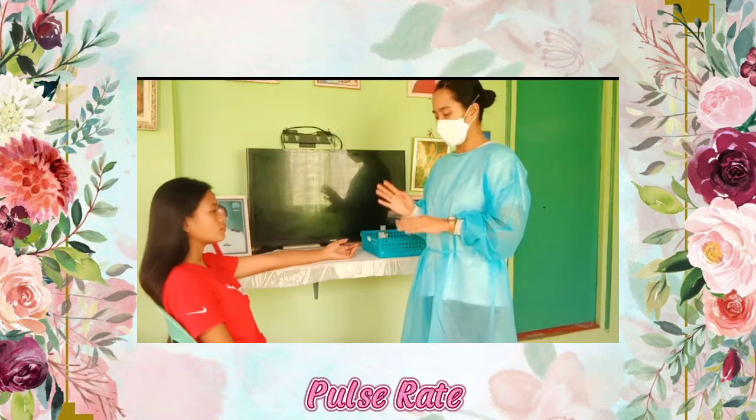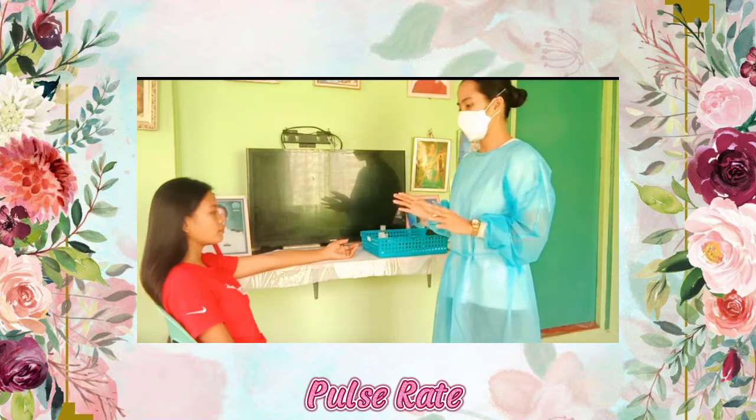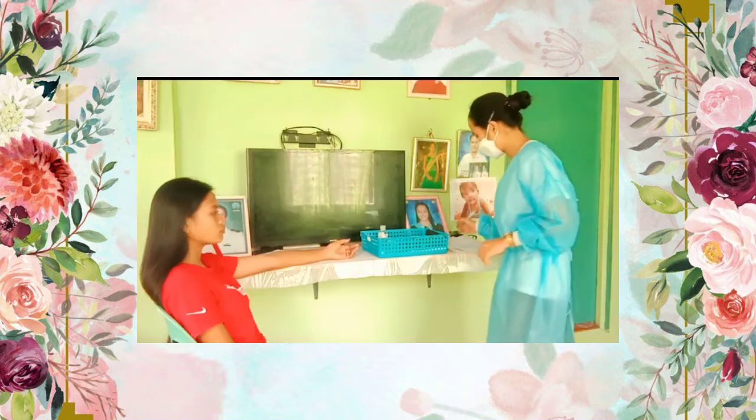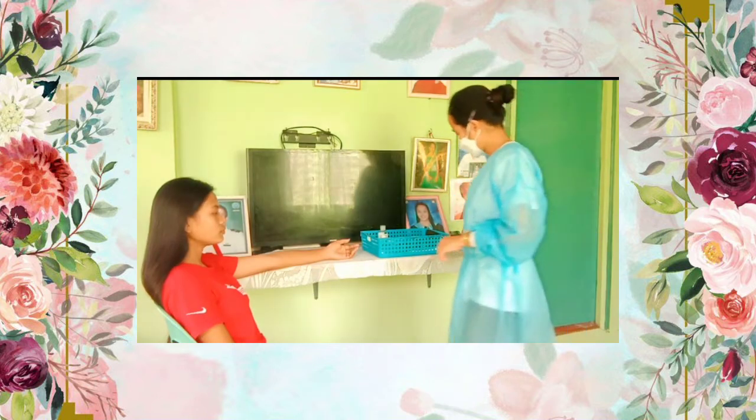Your pulse rate, ma'am, is 82 beats per minute, which is in the normal range for adolescents. The strength is normal or expected, which is given a score of 2. And now I am going to note the results.